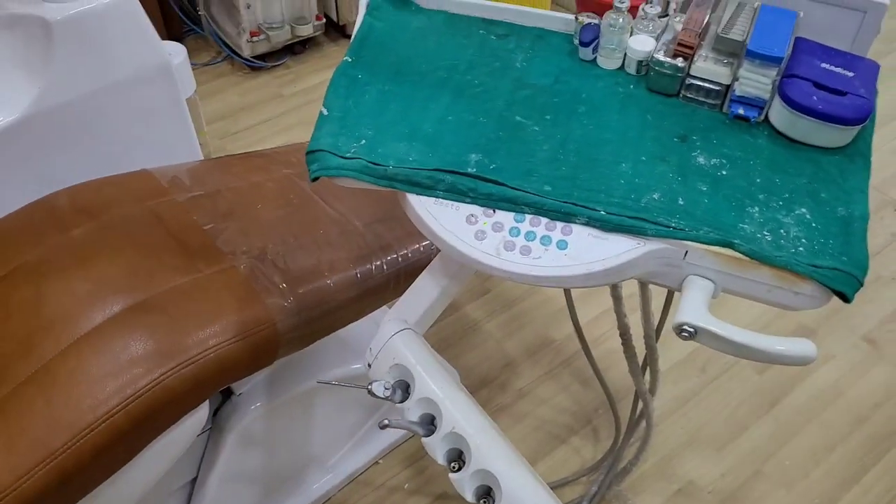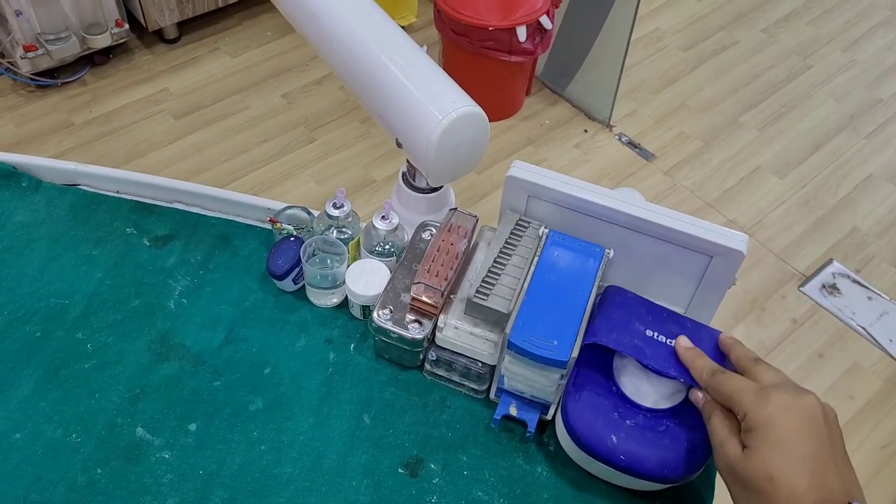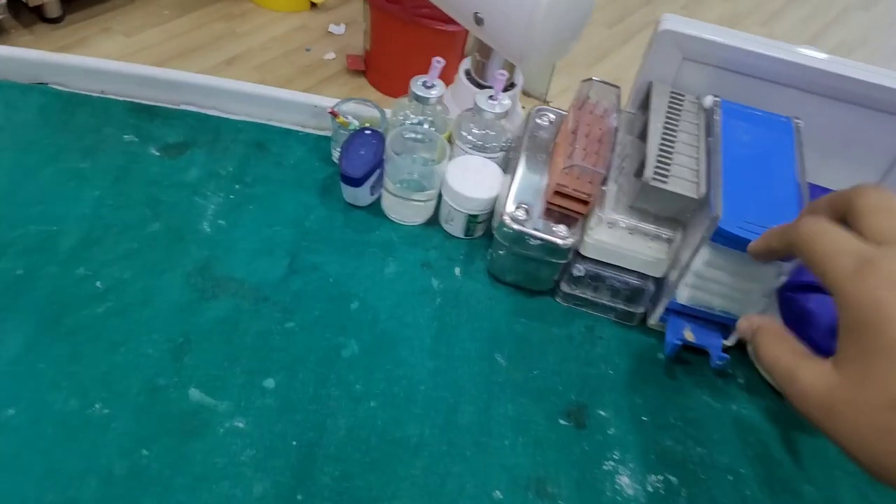First of all, let's start with the trolley. This is basically the cotton box, the cotton holder — we call these cotton rolls. These are the burs, here you can see. These are three burs.